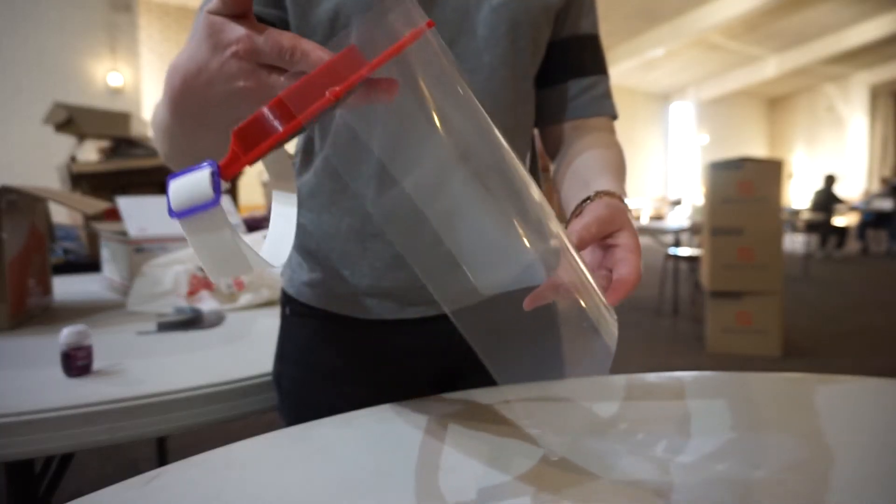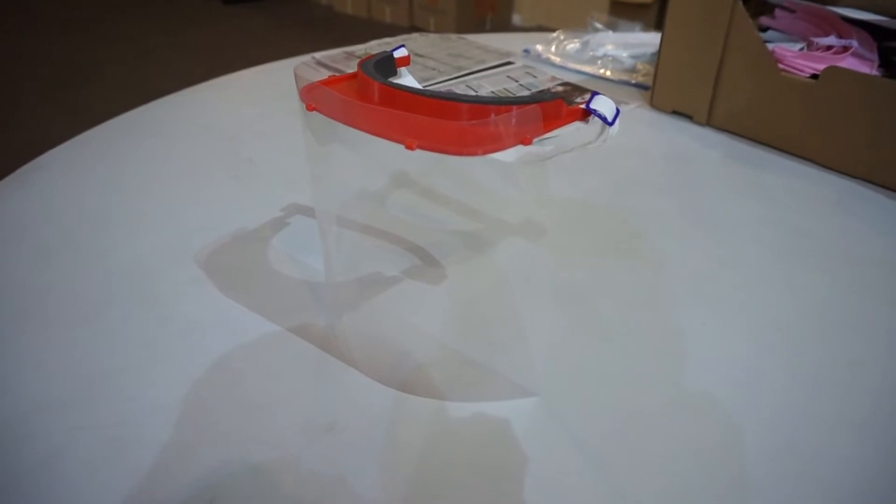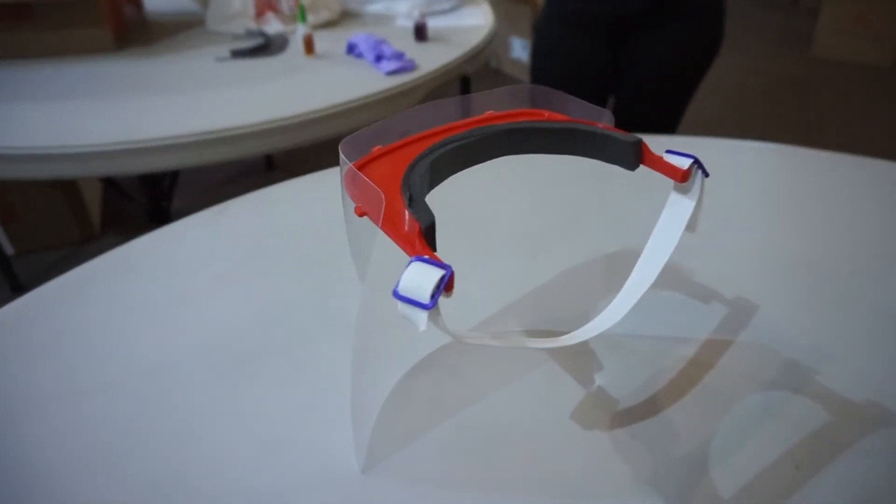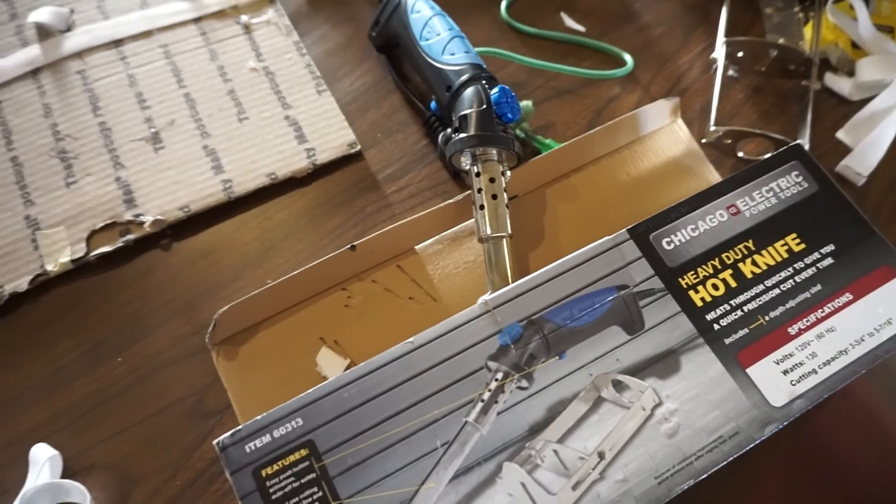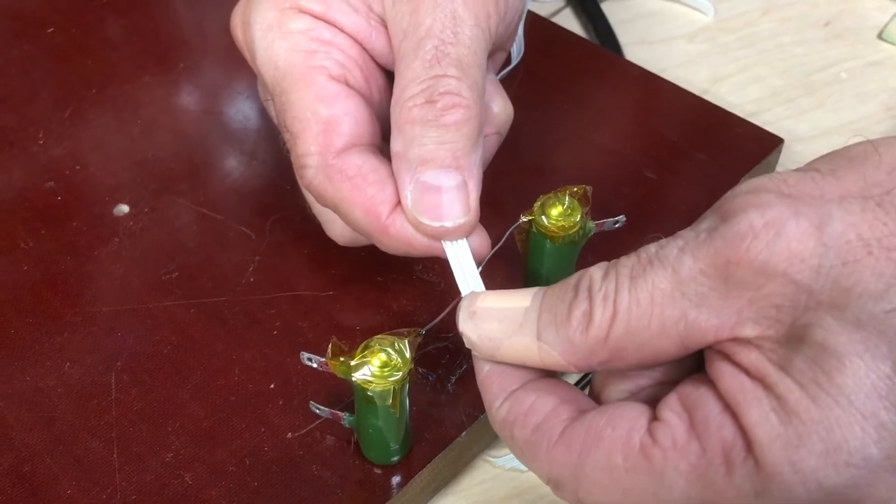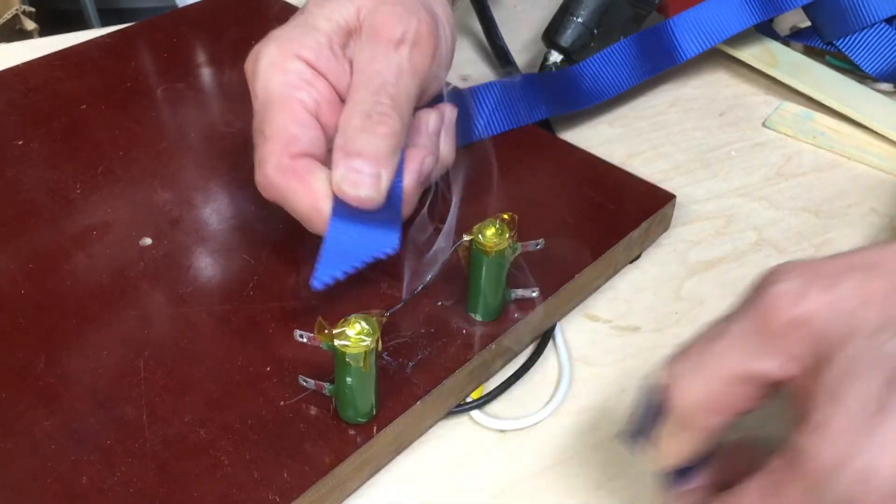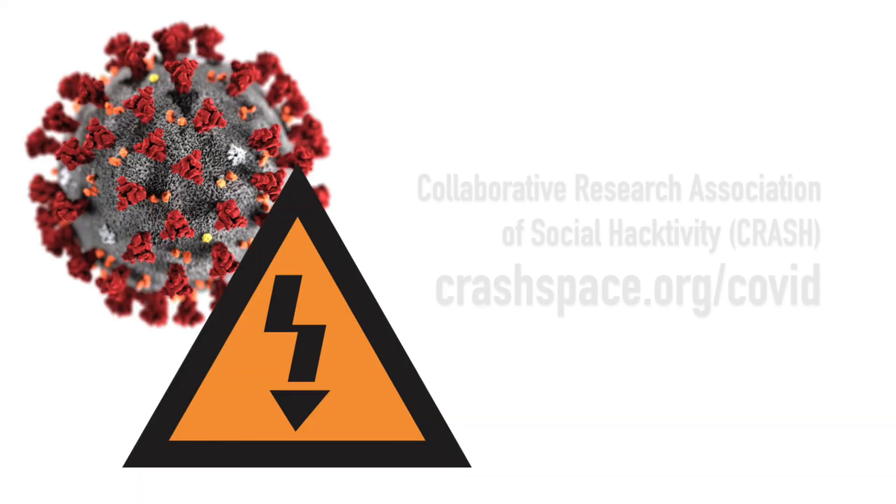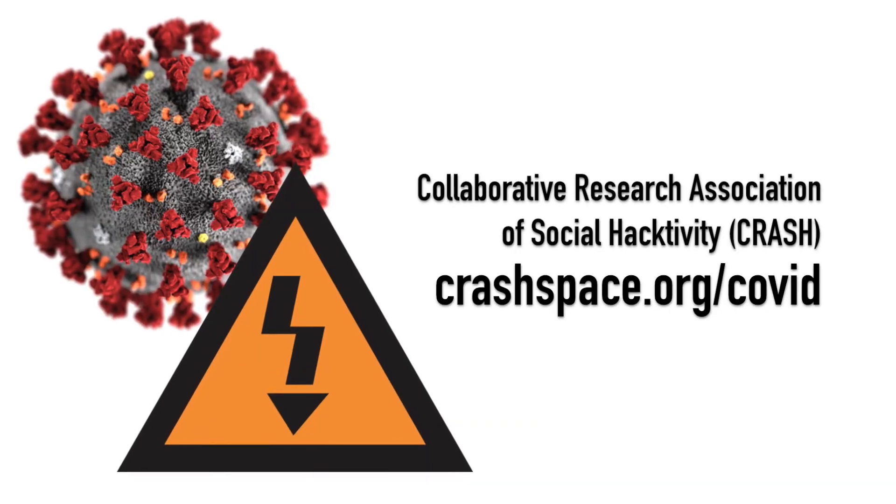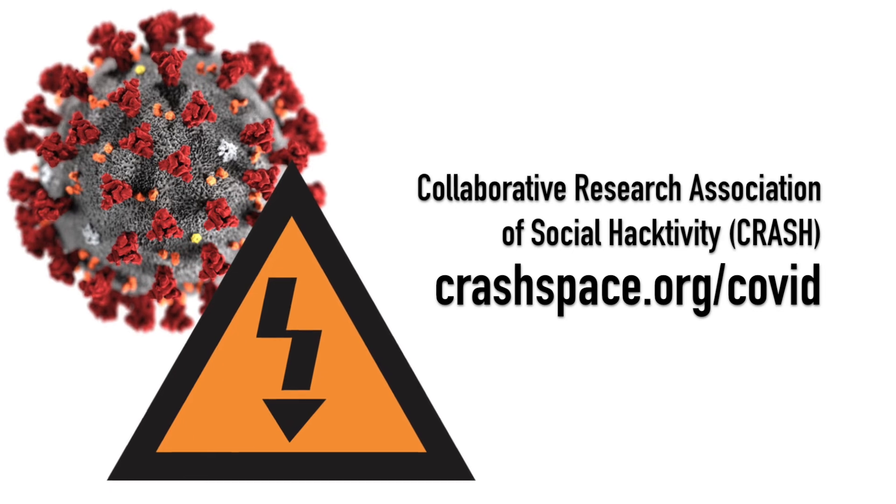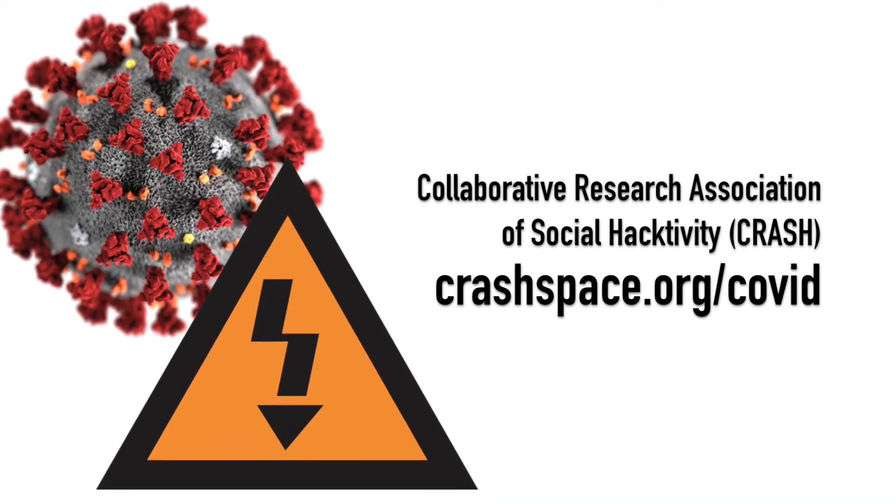Your face shield is complete. Other elastic cutting methods that can make large-scale assembly easier are using a hot knife or hot wire cutter. These will fuse the ends together and keep them from fraying. Remember to visit crashspace.org/COVID for more information on the Crash Space COVID response.